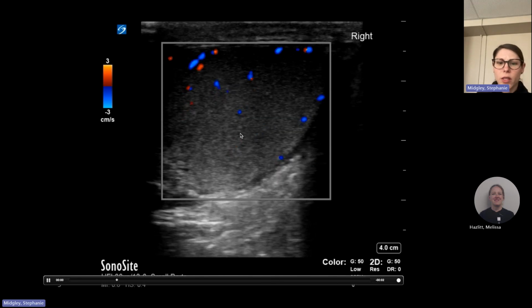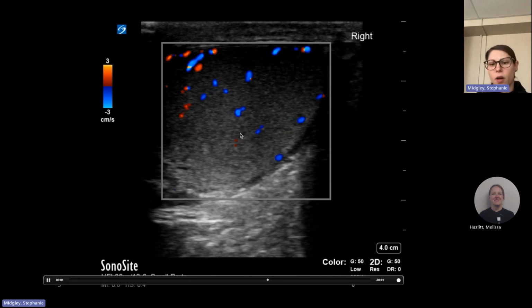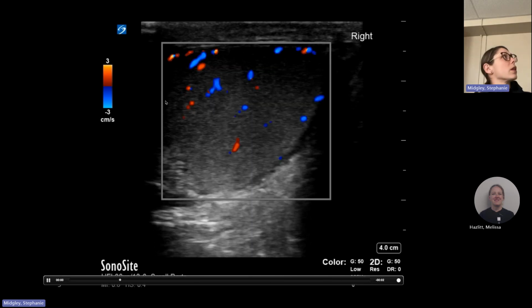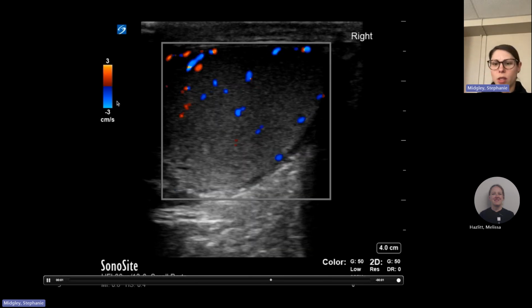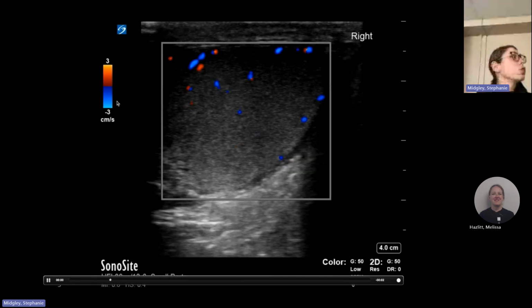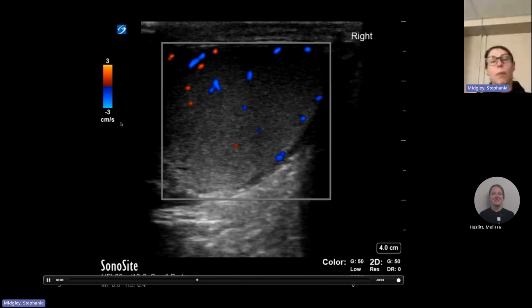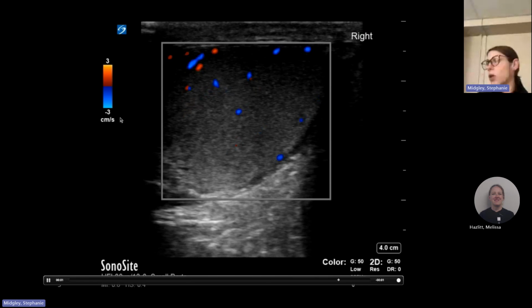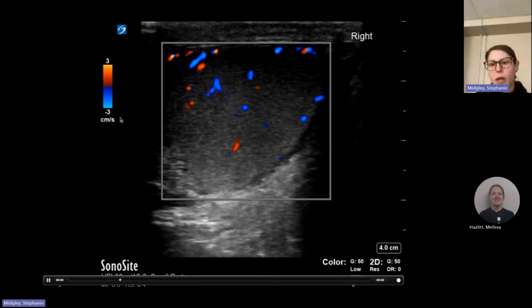Things you want to adjust is your PRF, which is the pulse repetition frequency. This one is like 3 to -3. Usually it's going to be about 1 to 2, or somewhere in that range. You can drop this lower if you need to, if you're not picking up any flow at the 3. So it's 3 cm/s. That's the slow rate it's trying to pick up.